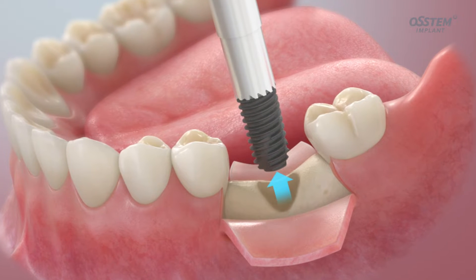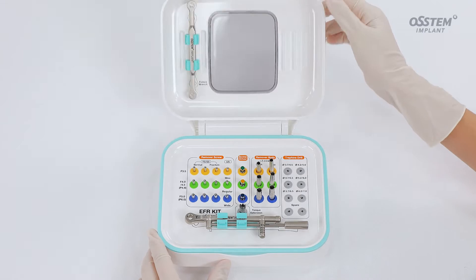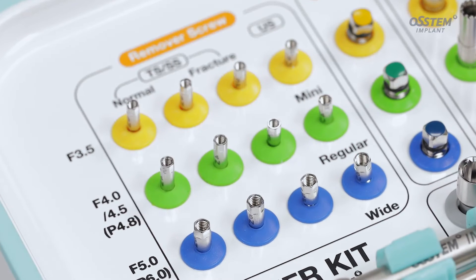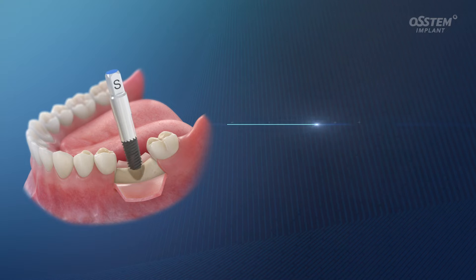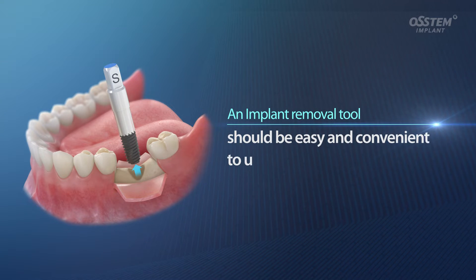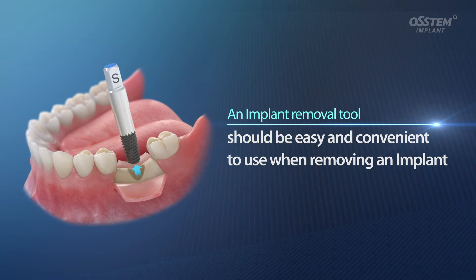When you have no option but to remove an implant, you can use this EFR kit, which helps remove the implant without affecting the surrounding bone. An implant removal tool should be easy and convenient to use when removing an implant.